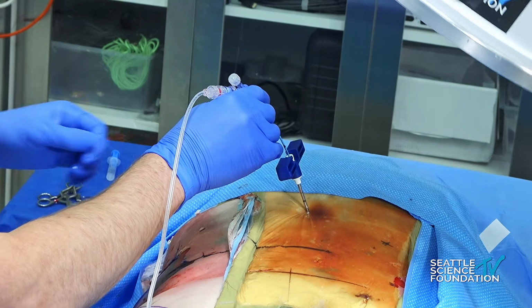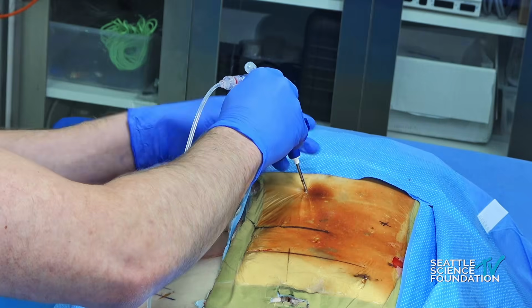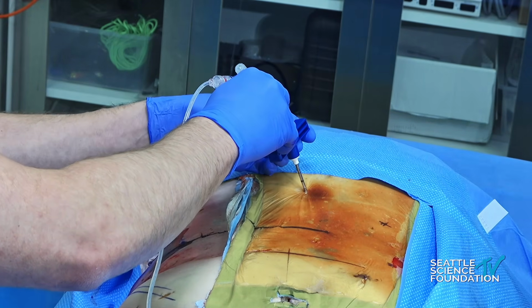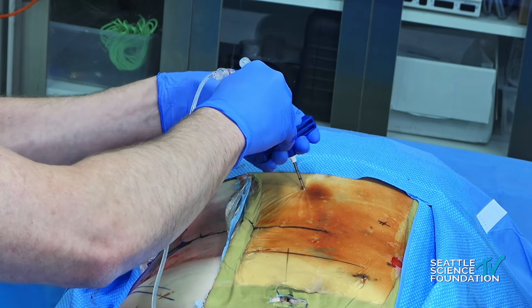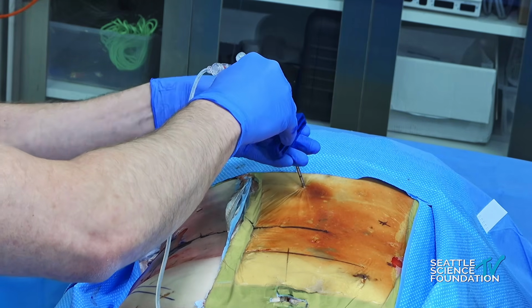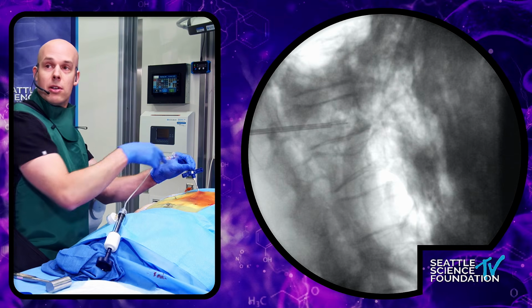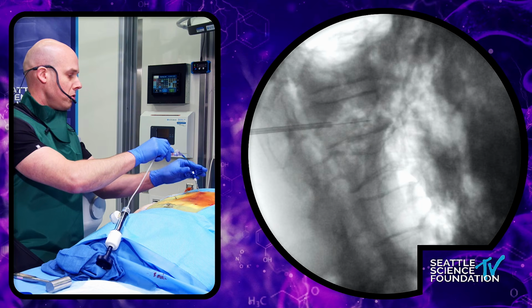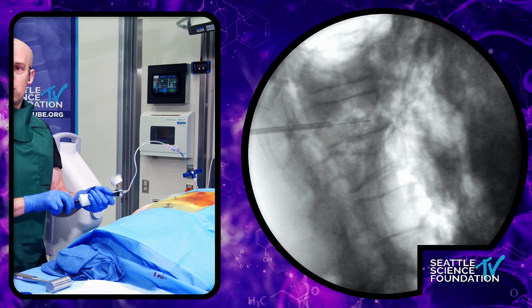And I think there was a comment this morning that you should work closely with your technologist. So we have Anthony here. Thank you so much for doing this back and forth AP lateral. Kyphoplasty and vertebral augmentation is a lot of AP lateral, AP lateral. And once you get familiar with your technologist, basically they know exactly what to do and when to do it. So now we'll be inflating the balloon.